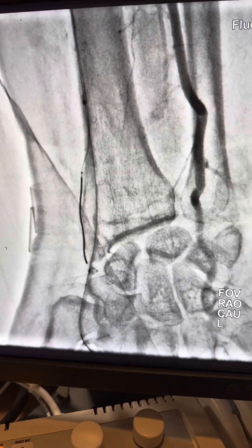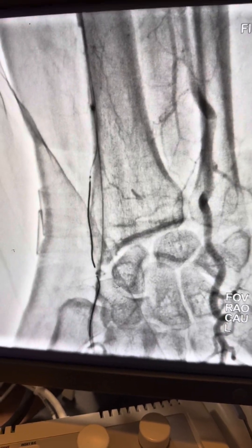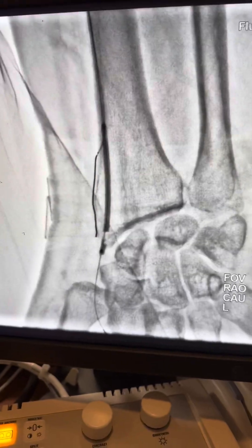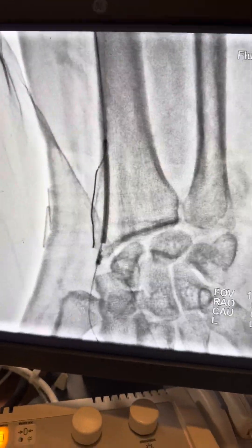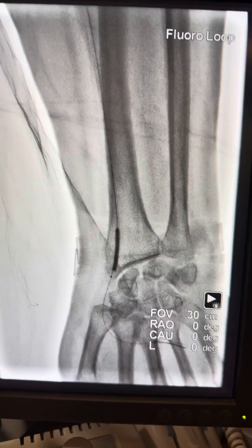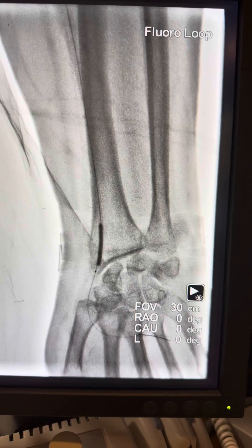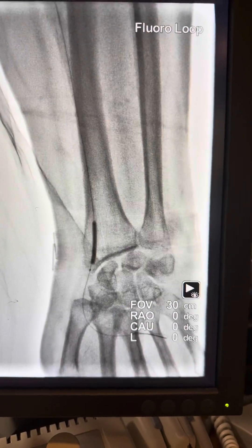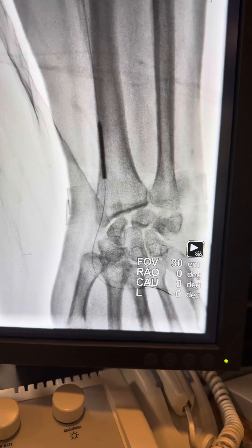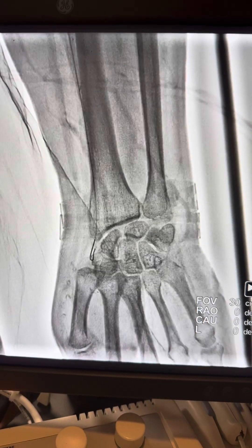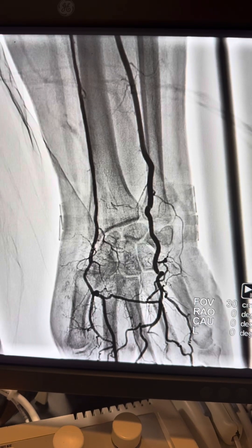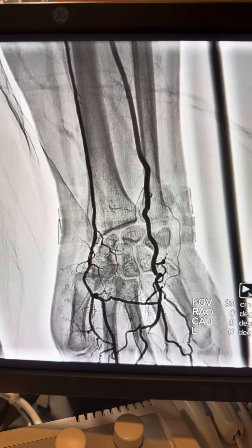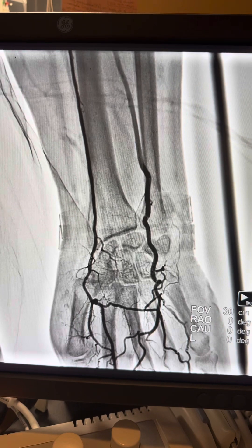Here is the distal injection to confirm we landed in the right spot. We then re-advanced the 2.0 balloon and inflated. We then upgraded to a 2.25 balloon, pulled the run-through, and kept only the Terumo wire. Multiple inflations were performed from distal to proximal, and here is the final result.